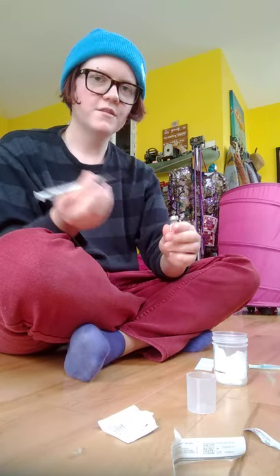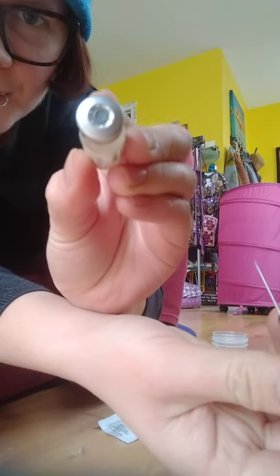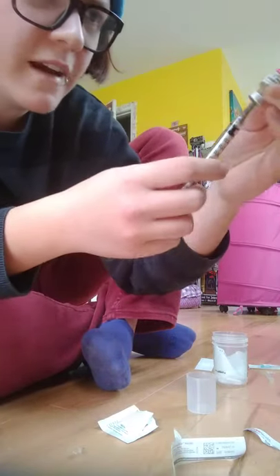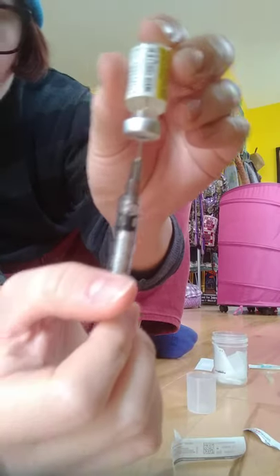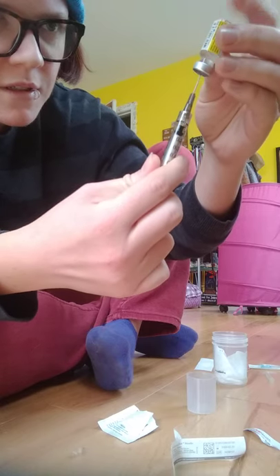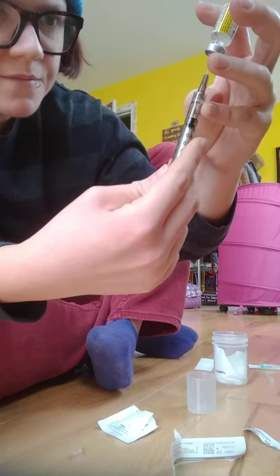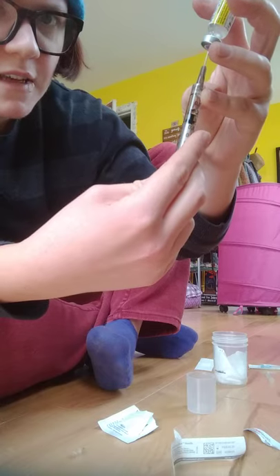Now you're going to stab the middle of the rubber stopper with the needle, then flip the bottle upside down. You'll see the bevel — a little curvature to the needle with the hole visible — and you want to face that towards you. With the bottle upside down and the bevel facing you, start drawing very slowly by pulling the plunger down. It's really viscous, meaning thick, so it's going to take a little while.